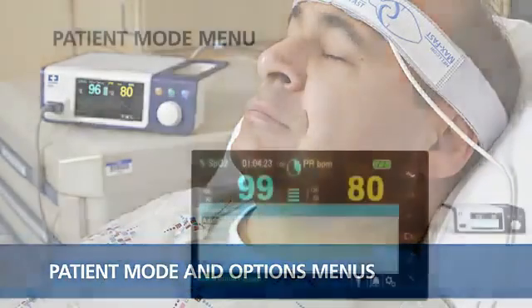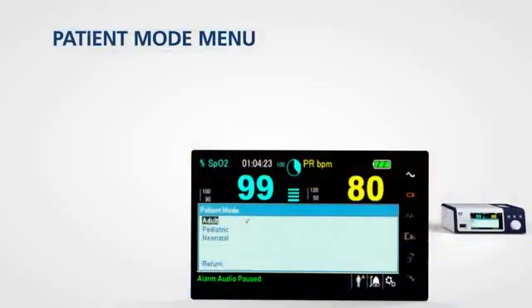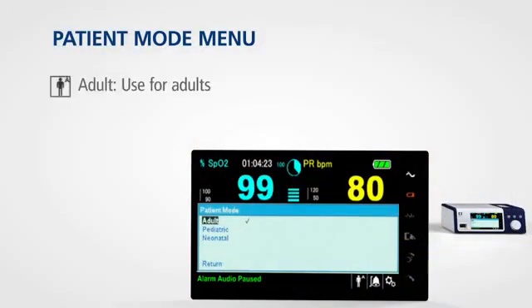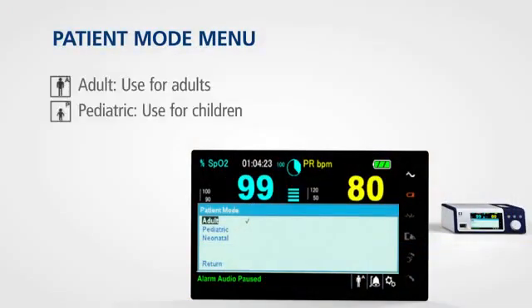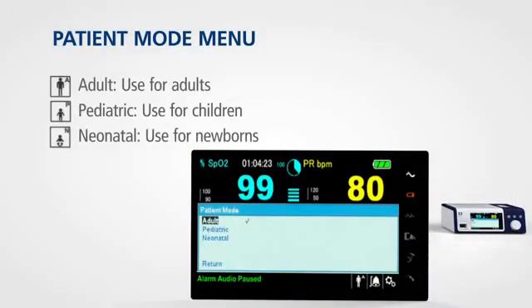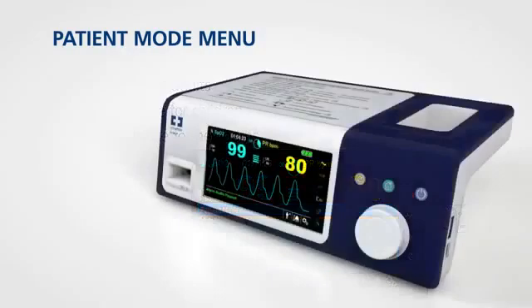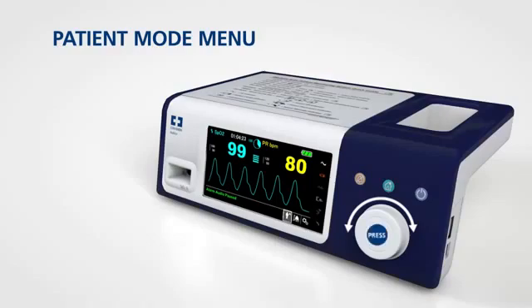The patient mode menu allows you to choose settings for adult, paediatric, or neonatal patients. To access this menu, rotate the jog dial to highlight the patient mode display area and press.